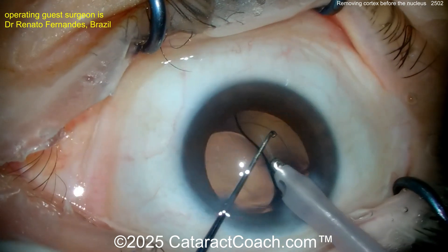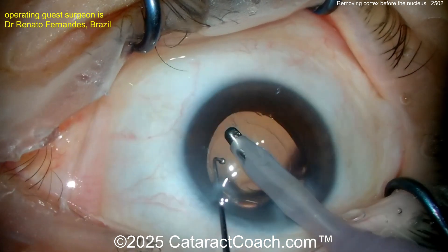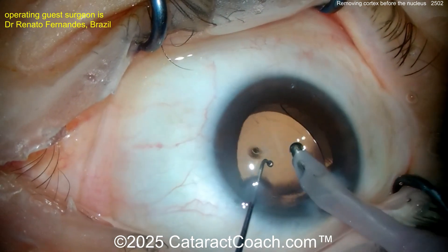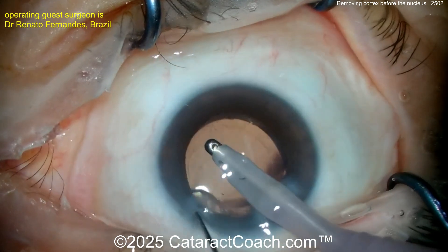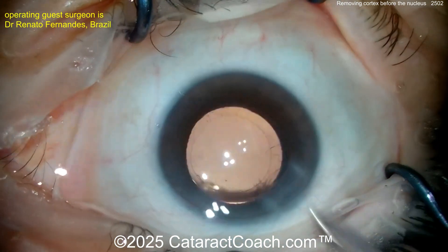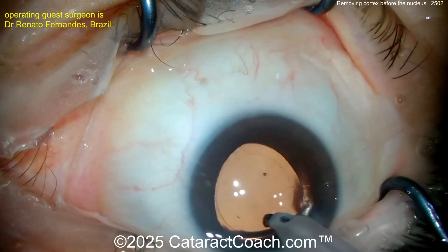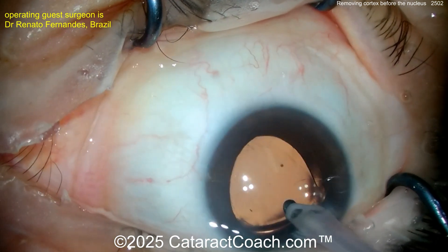Nice technique with the second hand. I like how this surgeon uses both hands at every step of the procedure — it really makes a lot of sense. When you see a one-handed surgeon from years past, it makes you wonder. You have two hands — it's like trying to cut a steak with one hand; I'd rather use two.